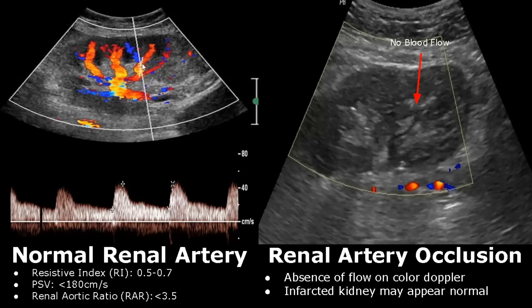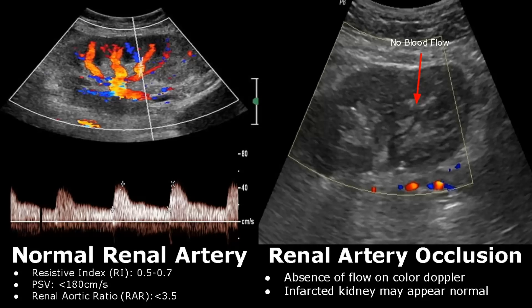The normal renal artery has a low resistance flow on spectral Doppler. There is continuous forward flow on diastole. The normal resistive index is between 0.5 to 0.7. The normal peak systolic velocity is less than 180 centimeters per second. Renal aortic ratio is calculated using PSV of renal artery divided by PSV of aorta. This ratio is usually less than 3.5, but some institutions use less than 3.